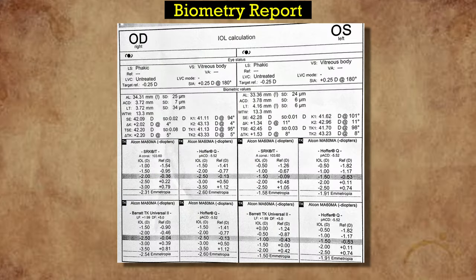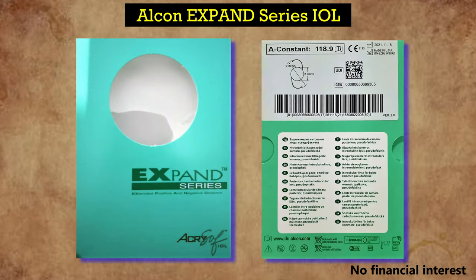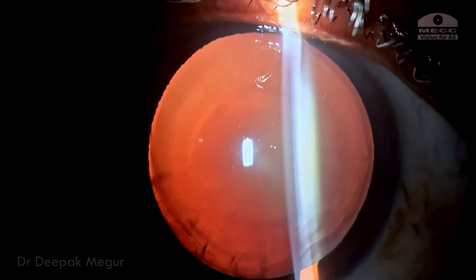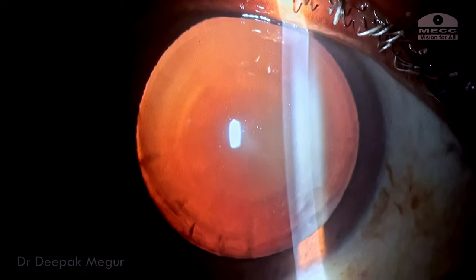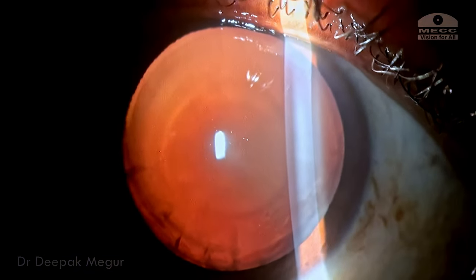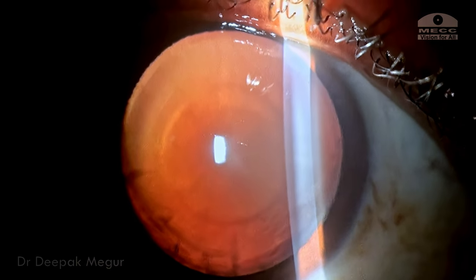These are the biometry readings and the axial length is very high — around 33 millimeters. The IOL calculation in Barrett has come to around minus 2 diopters. I'm going to use the Alcon Expand series minus 2 diopter lens for this patient. At this power we have very limited options, and I want to choose a lens which has the least potential for inducing PCO. We don't have the most ideal lens but this is one of the better options available.